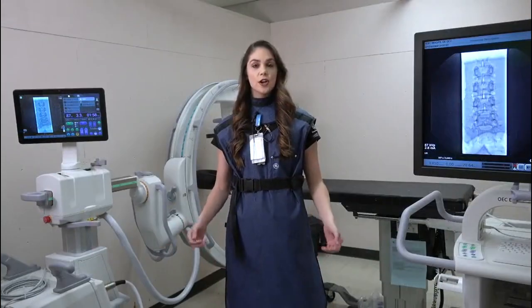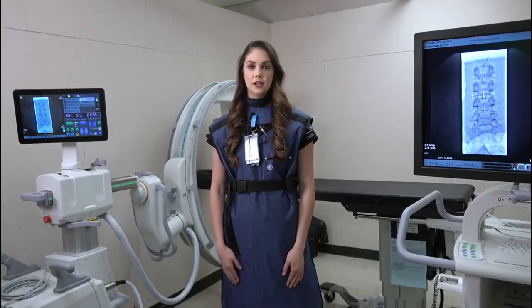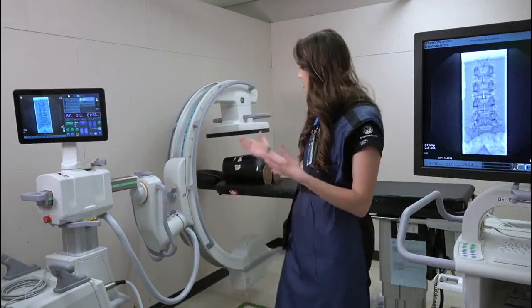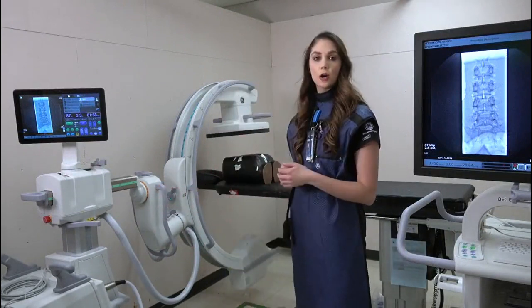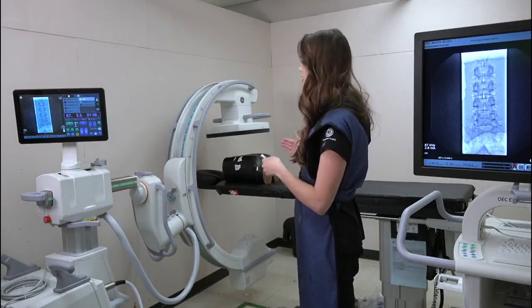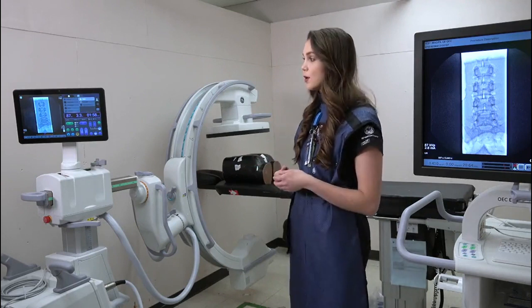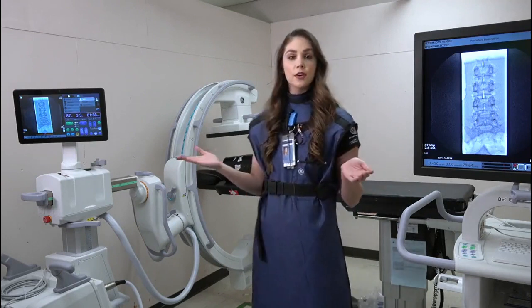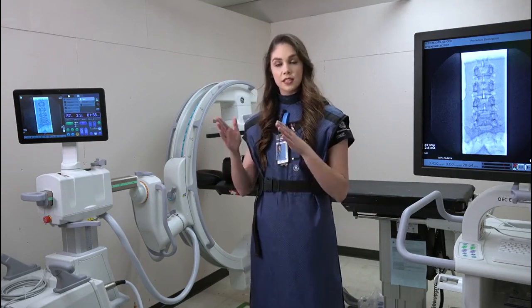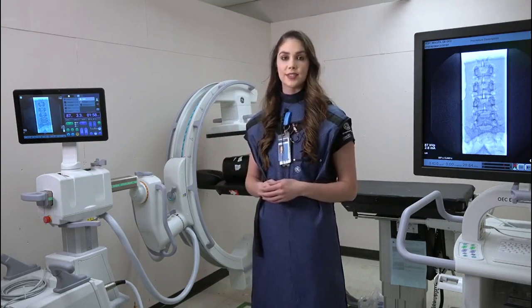We are going to start by setting up for a true AP position for one of our pain management cases. If you look at this system here, our goal is to pull the C-arm in perpendicular to the patient who is lying prone on the table. We want to make sure that the patient's body part is centered, as well as using collimation to help reduce dose.